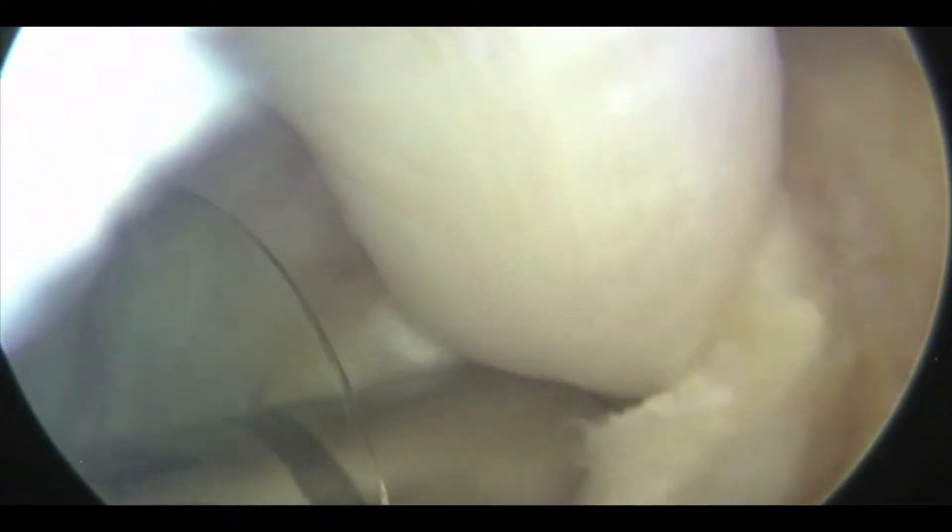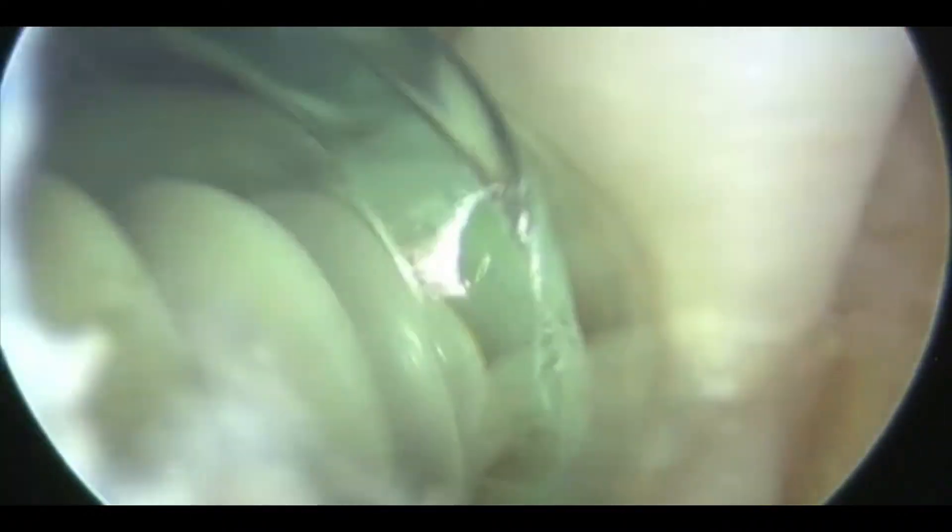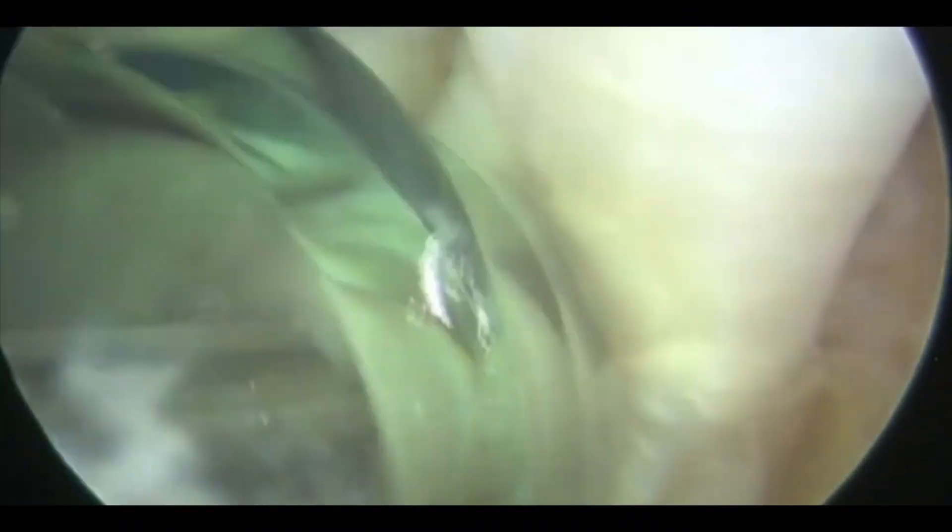Using the needle with a forked probe, we can then impact the tendon right down into the base of that socket. Having pushed that all the way down, we're then going to put a 35 by 7 mm interference screw and screw that in to get nice compression of the tendon within the socket. We're using the cannula to stabilise the tendon so it doesn't pull down, screwing that all the way in for a nice strong fixation.